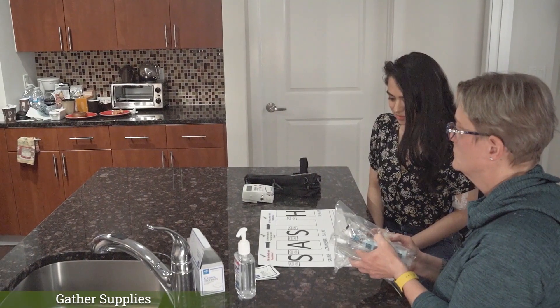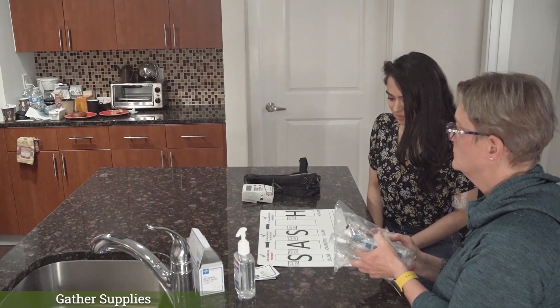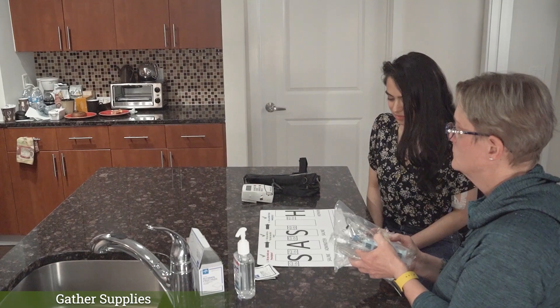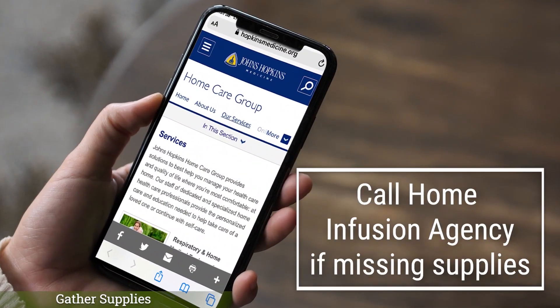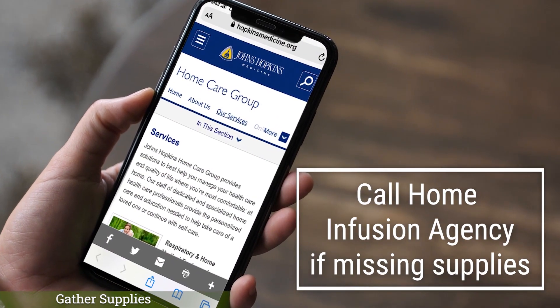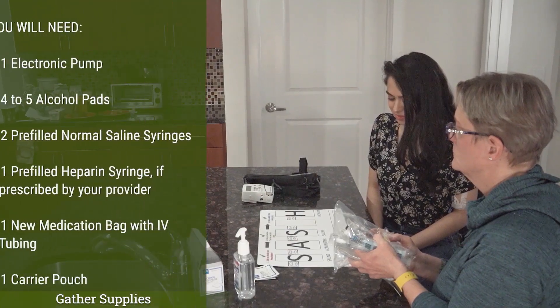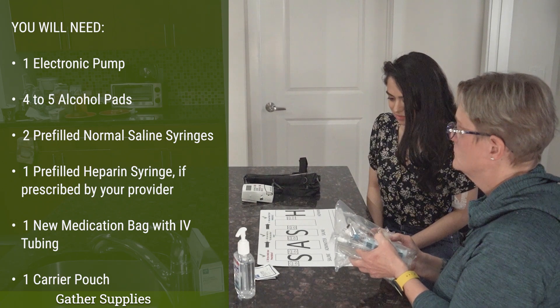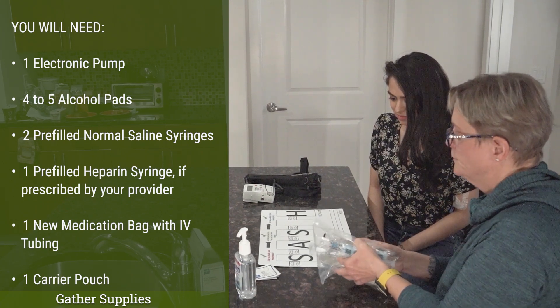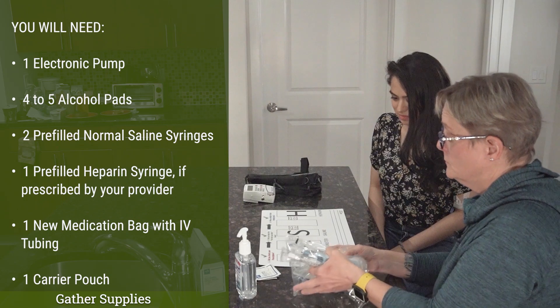The next step would be to gather your supplies. Your home infusion agency should provide these supplies. If you are missing any supplies, please call your home infusion agency. You will need your electronic pump, four to five alcohol pads, two pre-filled normal saline syringes, one pre-filled heparin syringe if prescribed by your provider, a new medication bag with IV tubing, and a carrier pouch.